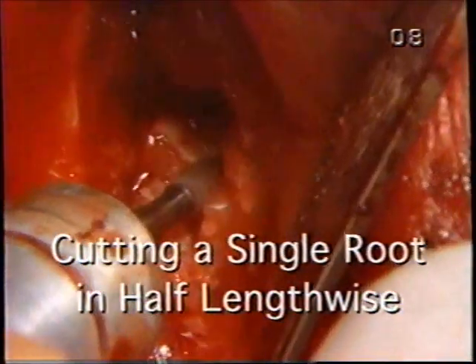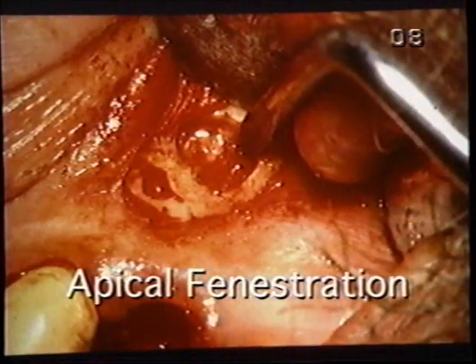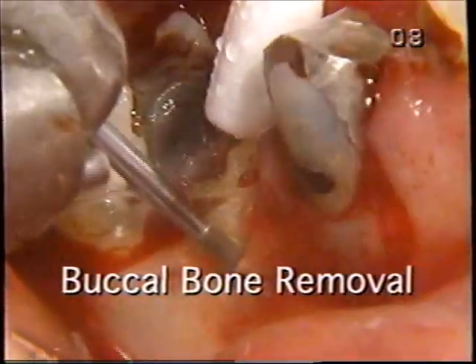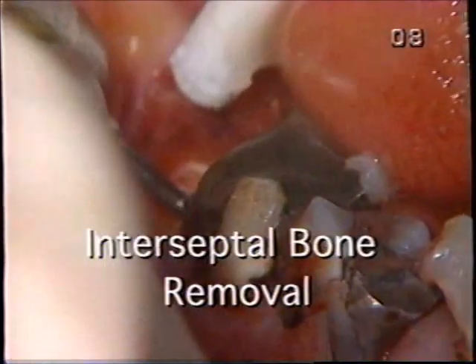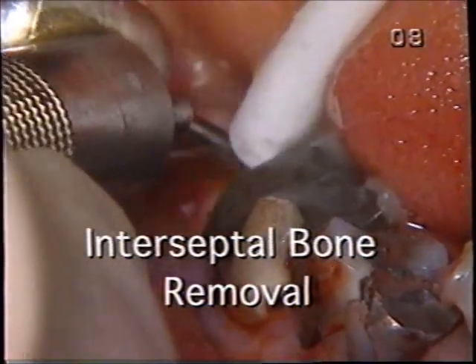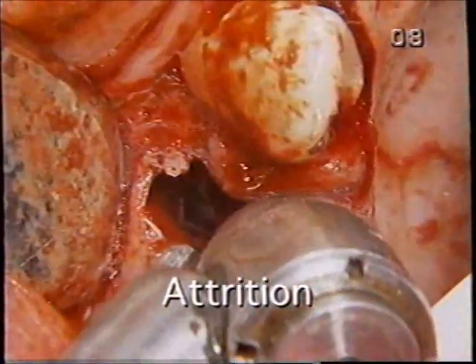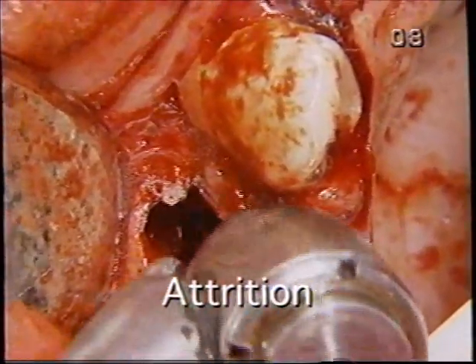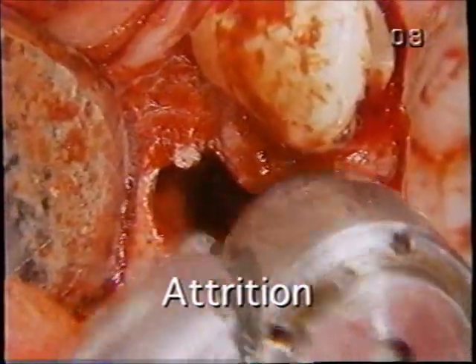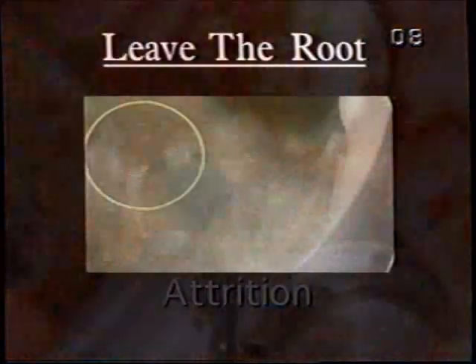Cutting a single root in half, lengthwise. Bone fenestration at the root apex. Buccal bone removal or buccal plate removal. Mesial or distal, what you might call interseptal bone removal, that is, between the teeth. Elimination of the root by attrition, particularly in the case of ankylosed roots. It may be the only way you can get it out is to dust it away, to drill it away.